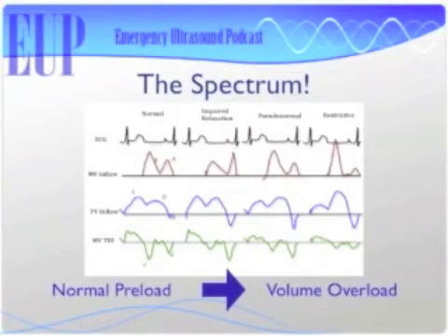So I wouldn't say that the IVC collapsing is probably okay. All right. So a patient who has heart failure, the complicating thing is their IVC is always going to be big. Okay. So when you're rolling your eyes, it's more about when I'm talking about the size, not the collapsibility. I'm just rolling my eyes at you in general, Matt. Okay. Right. It's more of a general thing.